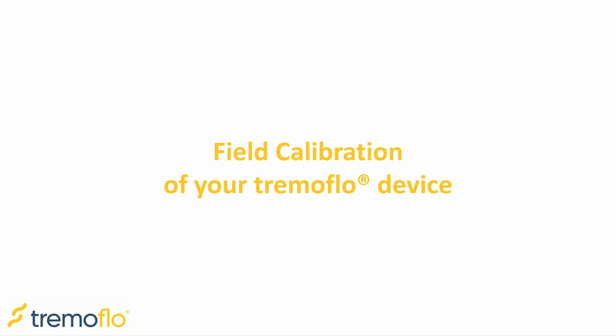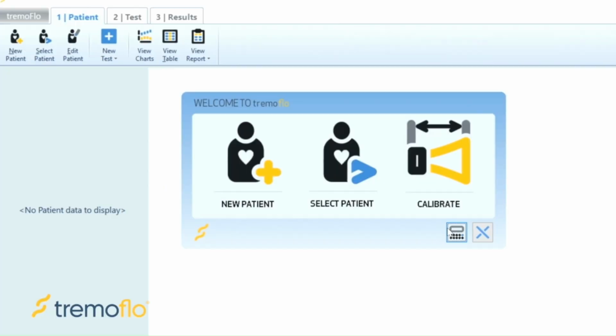In this section, we will discuss how to calibrate your TremoFlow and begin patient testing. First, we will walk through the calibration process. Your TremoFlow device must have been calibrated within the past 24 hours when a patient is tested. You can access the calibration wizard from the welcome screen.